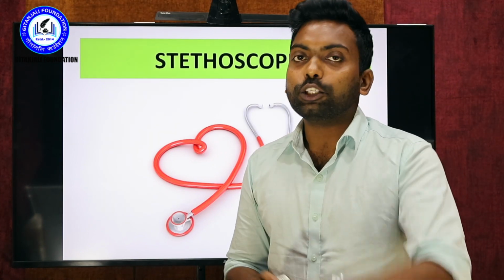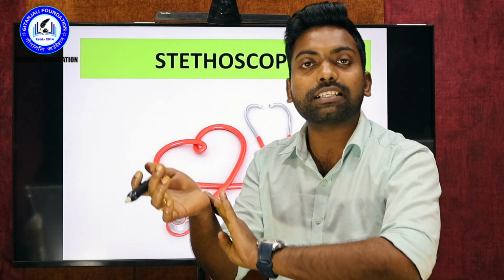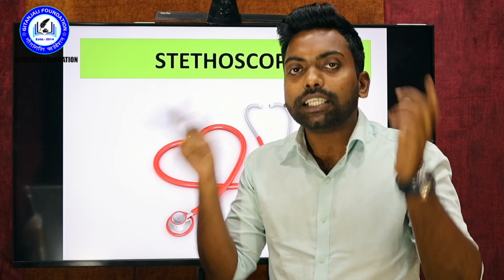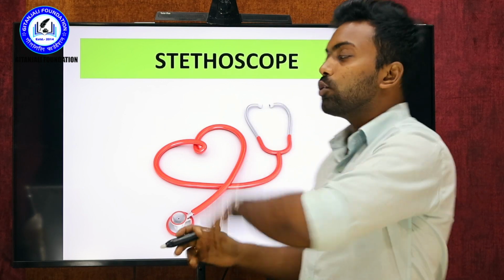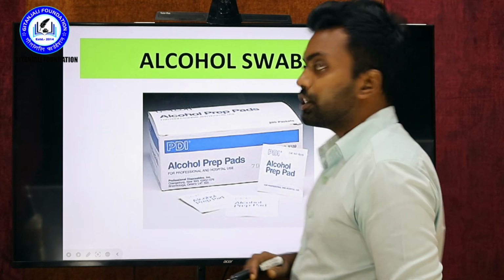As we know, there are two kinds of methods for checking blood pressure. The first one is the manual method, where we can do palpation of the pulse, and the second one is called auscultation. With the help of the stethoscope we can auscultate and hear the sound of the pulse. By that we can understand exactly how much the blood pressure is. So that is the second article for blood pressure measurement.